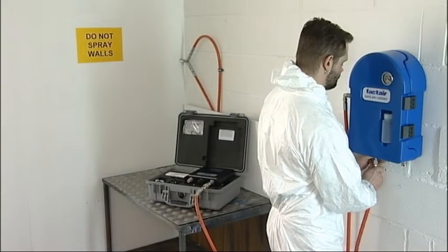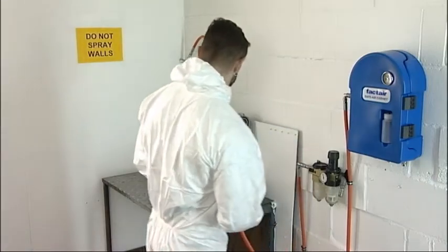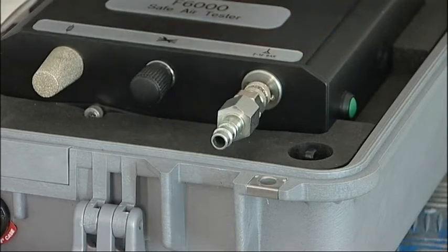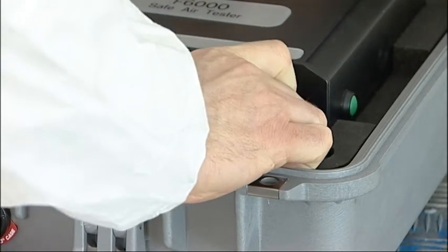To disconnect the tester from the system, make sure you leave the inlet adapter on the instrument and only disconnect at the end of the supply hose. The adapter can then be disconnected afterwards if required.